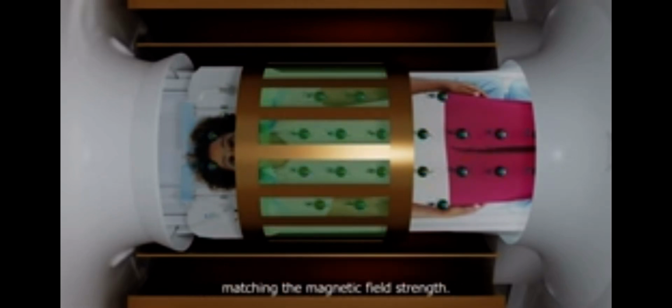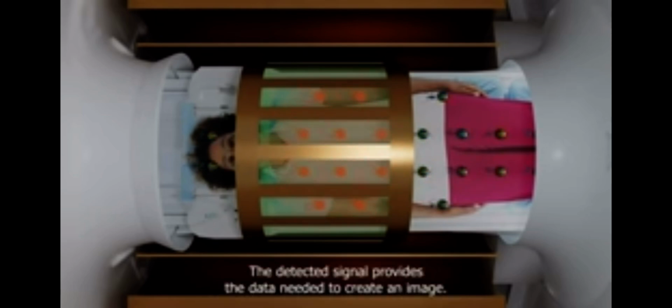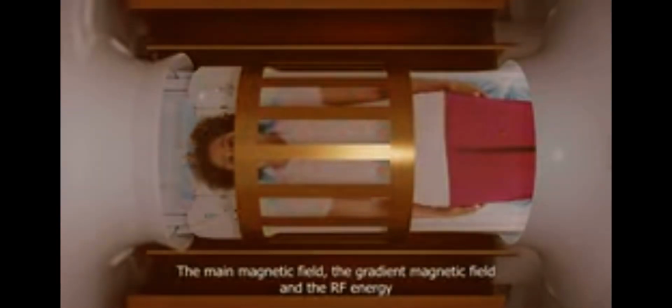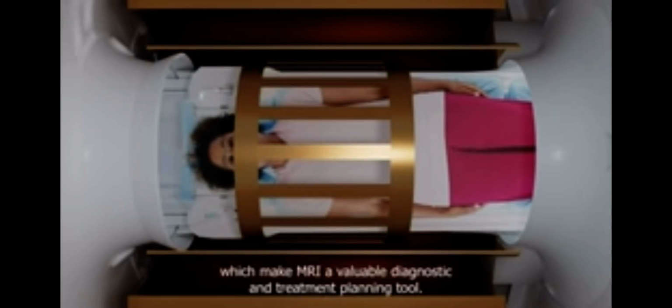The RF transmit coil broadcasts a radio frequency signal at a given frequency, matching the magnetic field strength. This matching frequency is known as the resonant frequency. The targeted protons absorb the RF energy. These excited protons produce an RF signal, which is picked up by the RF receive coil. The detected signal provides the data needed to create an image. The main magnetic field, the gradient magnetic field, and the RF energy combine to create detailed images, which make MRI a valuable diagnostic and treatment planning tool.